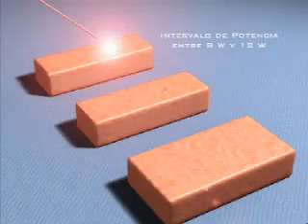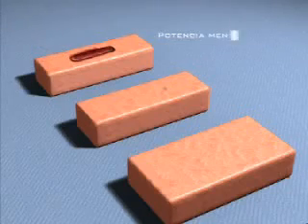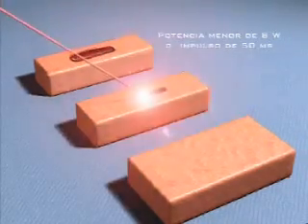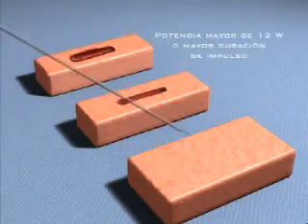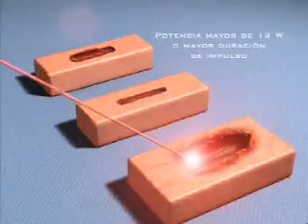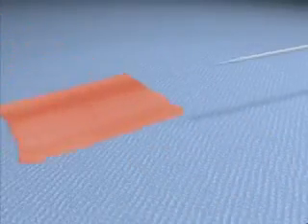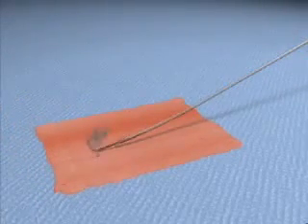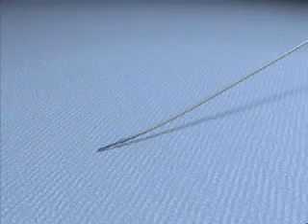A power setting of 8 to 12 watts will give fast, deep incisions. A pulse width of 50 milliseconds will give gentle, precise incisions. Increasing the laser power above these levels will produce iatrogenic burns. For a faster effect on tissue at the initial contact, it may be useful to establish a microcarbon plane on the tip of the optical fiber by first firing the laser on the test material.